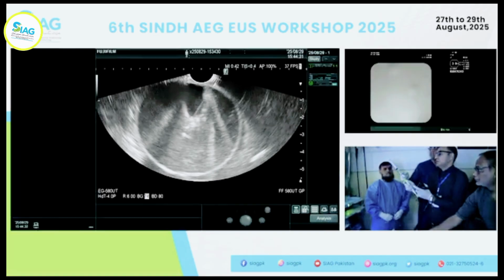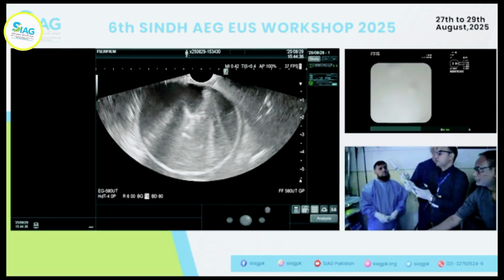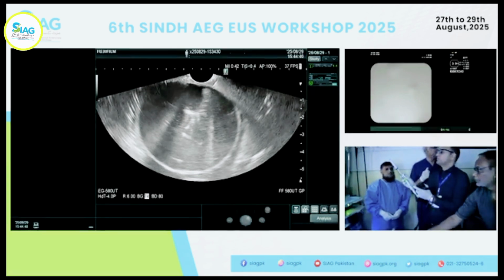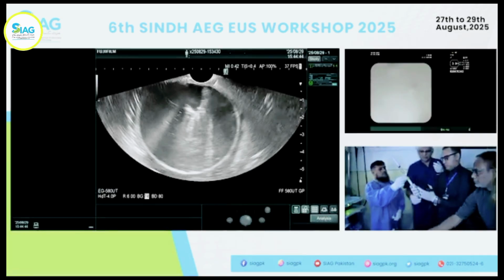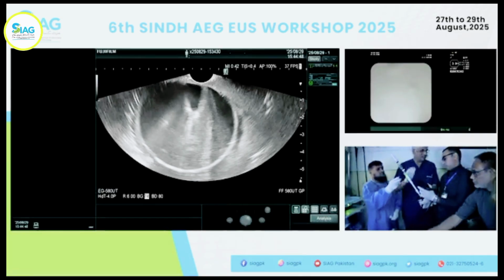So you've got stuff coming there. Yeah, that's a pseudocyst. Okay? Got it? Got it. Right, fine. So what we do is wait. Always, this is a standard thing.